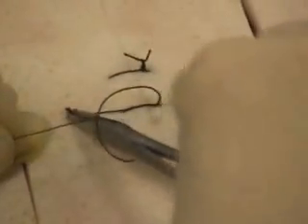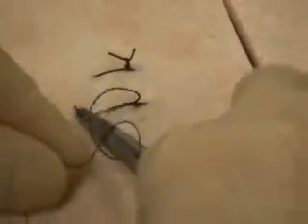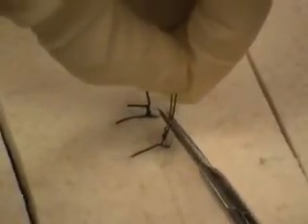So in between, over once this time, because we don't need to do it twice except for on the first throw. And we're just going to keep repeating those steps. And probably 3 to 4 knots is adequate. And at the very end, we'll go ahead and pull the whole thing over, and we're ready for cutting. So that was your simple interrupted with an instrument tie.